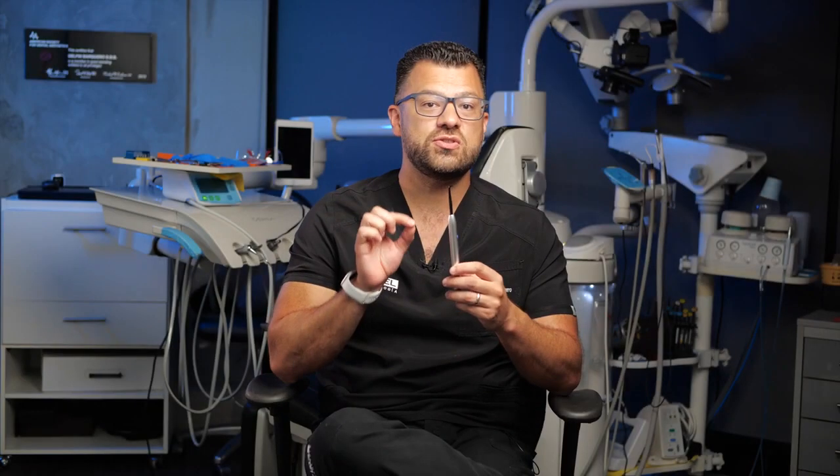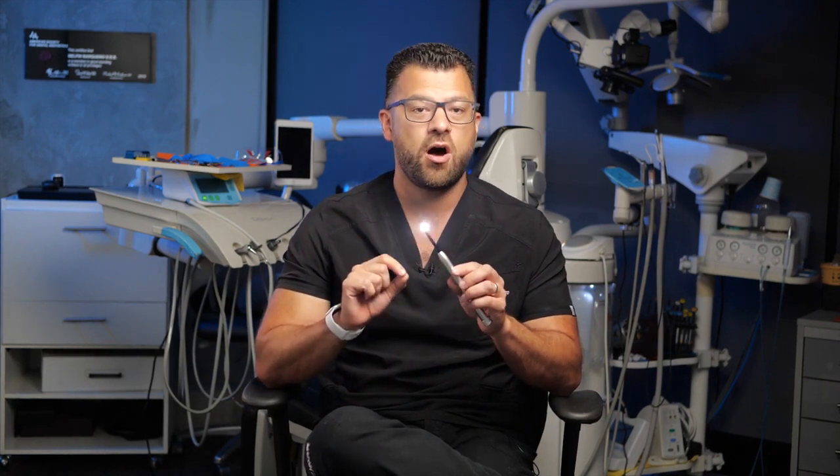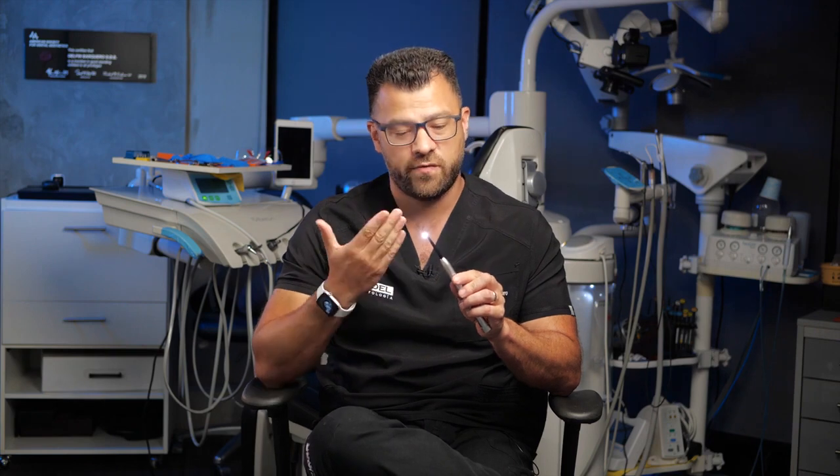The MicroLux 2 Transilluminator from Adent is used for detecting anterior and posterior caries. It also helps to visualize crown fractures, root canal orifice, and root fractures, often without the need for x-rays.